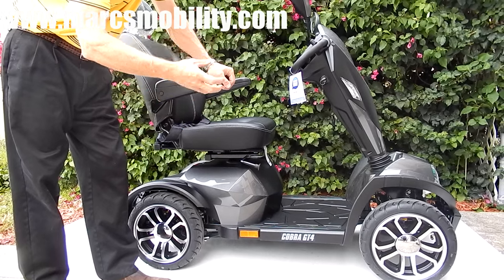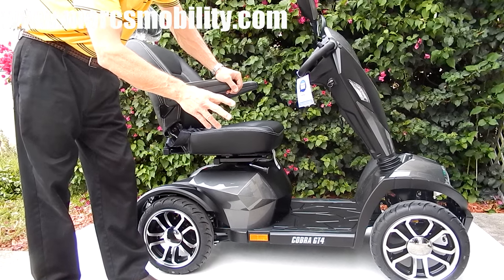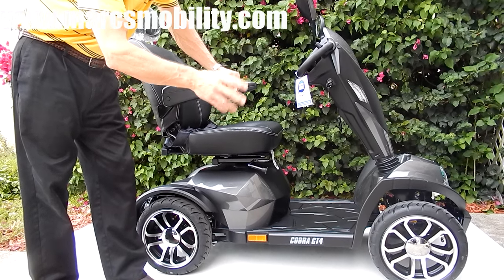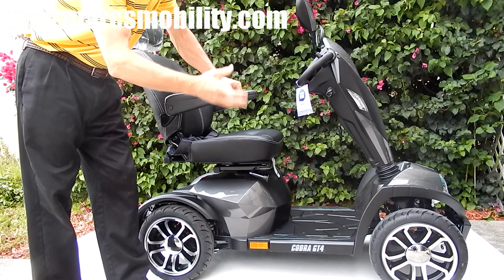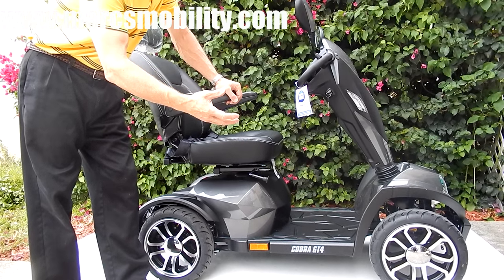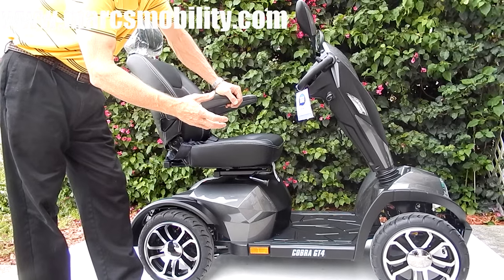This scooter will go 10 miles an hour. Also, this scooter is one of the few that has a 35-mile range. You can drive 35 miles before you recharge your batteries — you may get closer to 30, but it does have a 35-mile radius.